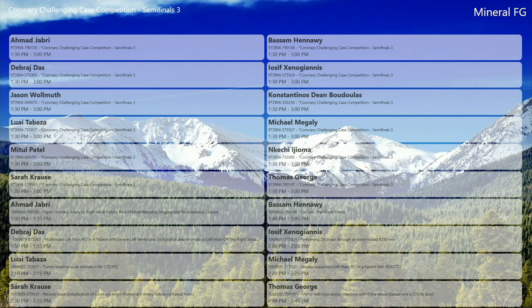And so balloon pumps and Impellas oftentimes don't give you much help. Most of the time, all they need is some fluid and time, potentially a right-sided Impella if they're fully in shock, or worst case scenario, even ECMO. But in this case, because it was feeding the entire right, you've got to have a low threshold to quickly evaluate the LV EDP, and consider hemodynamic support.